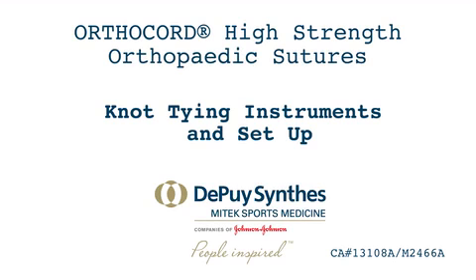In this video demonstration, you will learn about the instrumentation used for arthroscopic knot tying, as well as the different types of knots utilized in arthroscopic surgery. Ultimately, the type of knot you use in your cases will be up to you and your attending physician.